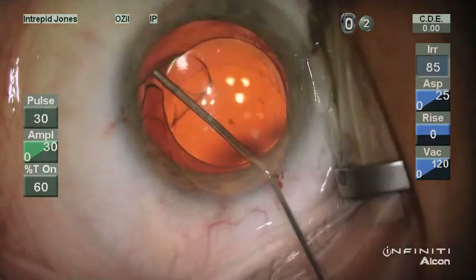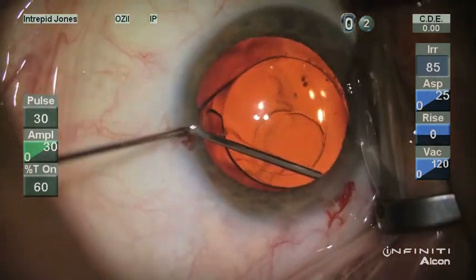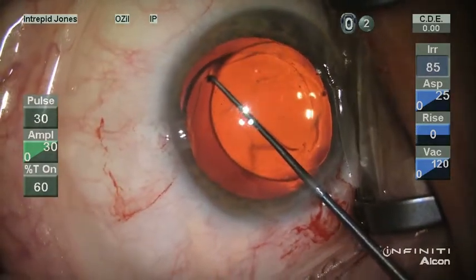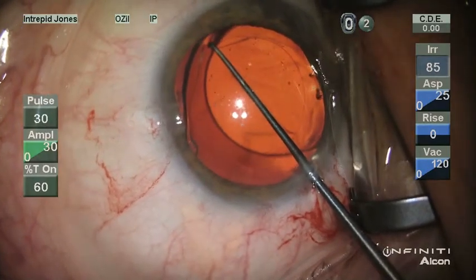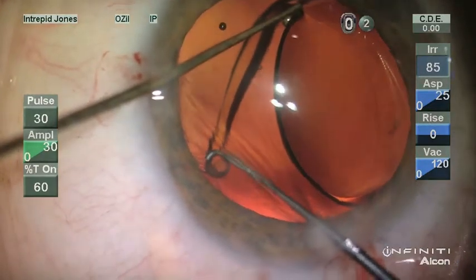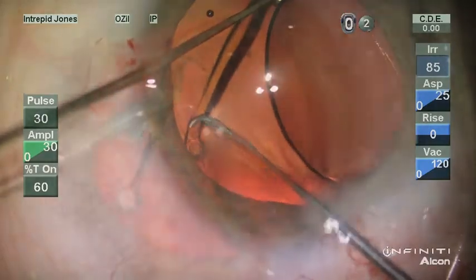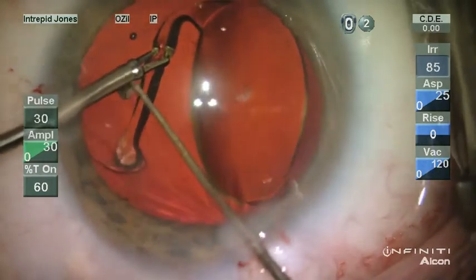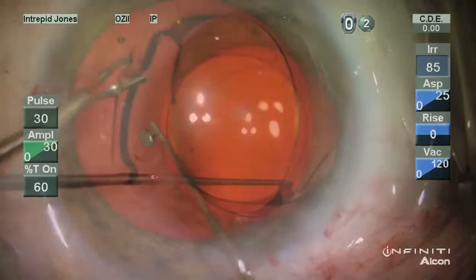In this case, seven months post-op from restore implantation, distance uncorrected vision was 20/20 and near vision was 20/30 uncorrected as well. However, it was apparent that this lens was not well-centered as it was decentered relative to the undilated pupil. During visco-dissection, it was apparent that this lens haptic had become stuck to the end of the eyelet of the capsular tension ring, which had been placed in this mildly myopic patient.